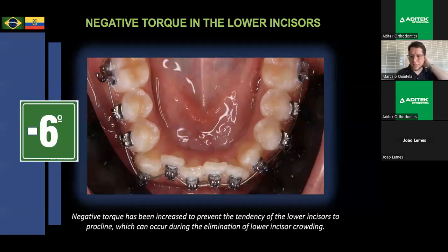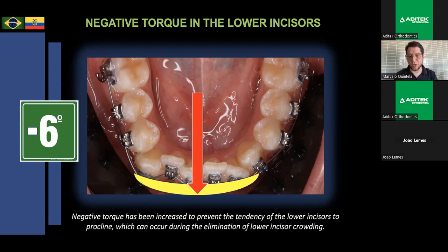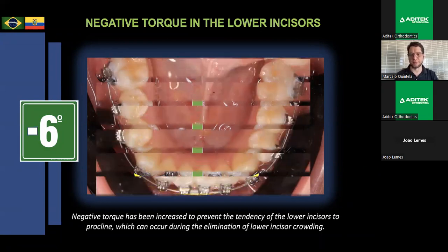So negative torque has been increased to prevent the tendency of the lower incisors to procline. Look, if you have crowding, of course, they want to procline, as in this situation in yellow. But if you put a negative torque, in this case blue, like the MBT, you have minus 6 degrees. Vestibularization can occur during the elimination of lower incisor crowding, but you can do something that neutralizes this situation. Look.